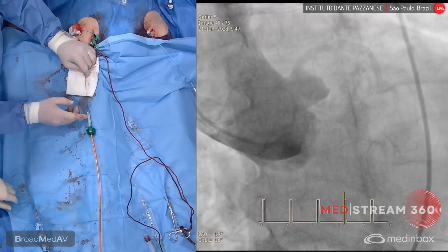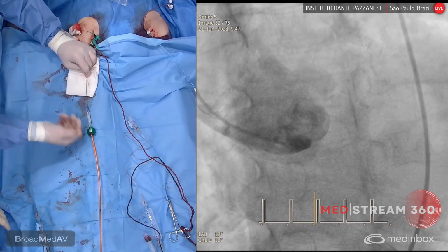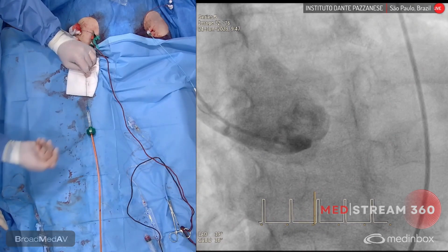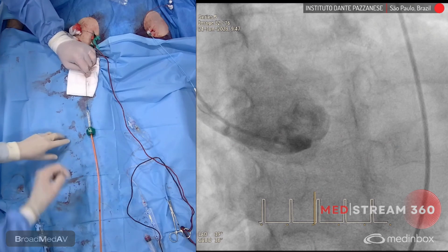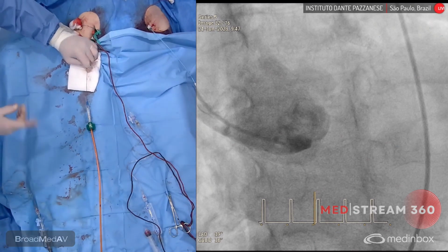It's also important to check the valve orientation. We have the external PET cuffing here, directed in the distal part, and the open cells region in the proximal part. Can you zoom this, please? Thank you. So it's aortic position. I think we can move on.